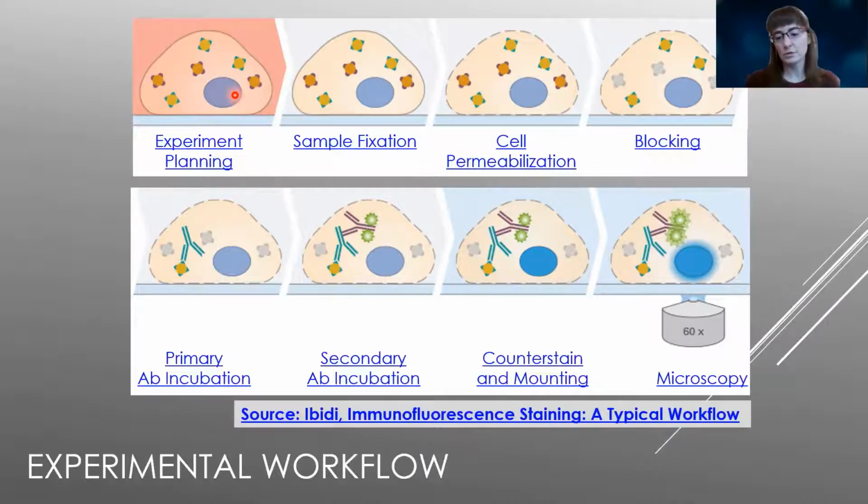Although it is possible to do immunofluorescence without fixation, the norm is to use it. What that does is it cross-links all of the proteins into place so that they're no longer diffusing. This means that you're going to get higher spatial resolution than if you left things unfixed. And it also means that the process of staining won't change your tissue.